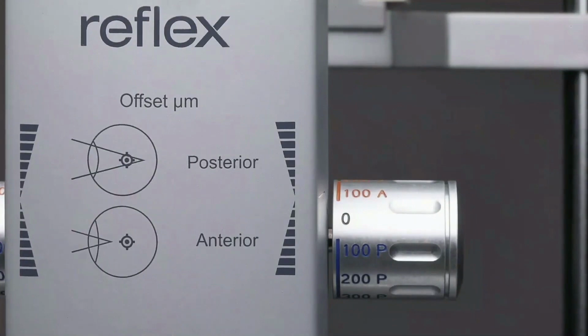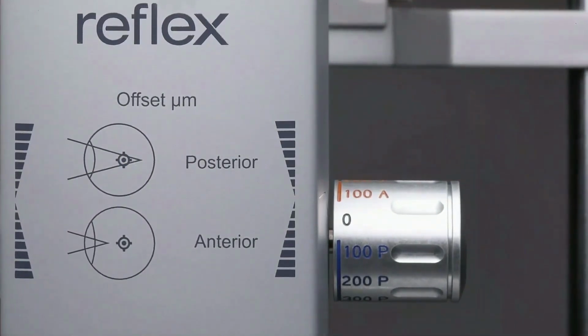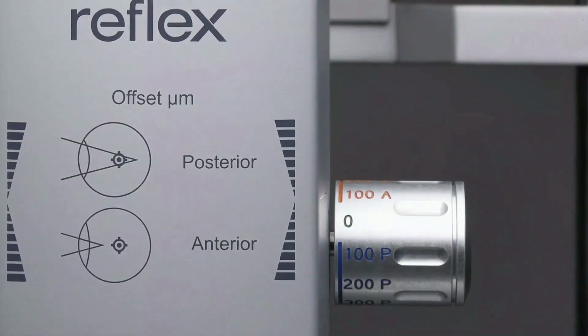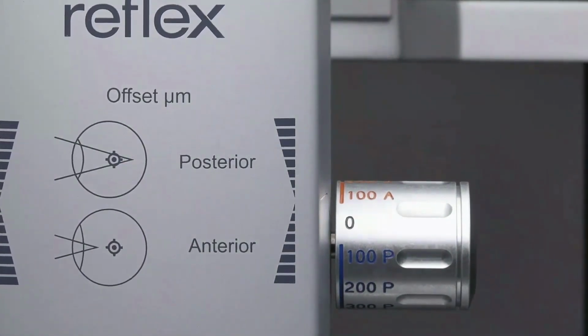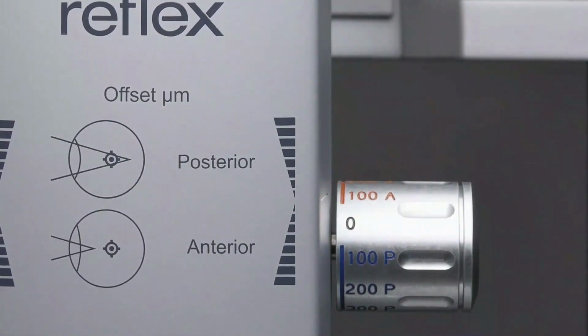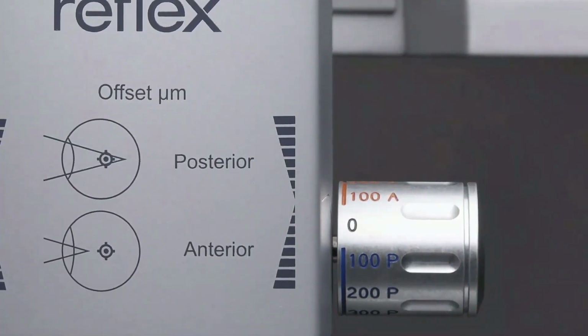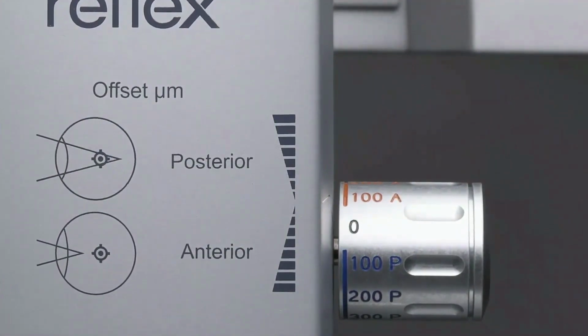Now, with an awareness of the high degree of temperature anticipated at the laser focus, it would make sense to maintain a sufficiently safe distance between the IOL and the plasma formation. Many lasers include a manually controlled offset, allowing you to move the treatment beam posteriorly towards vitreous by 0.1 to 0.5 millimeters.